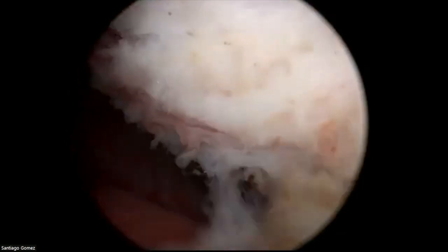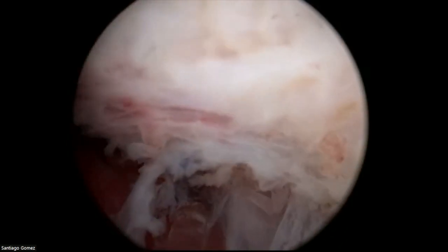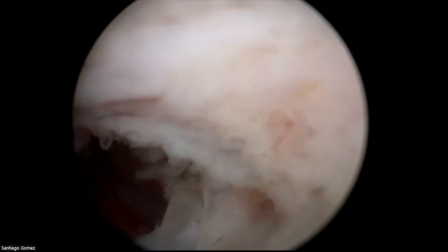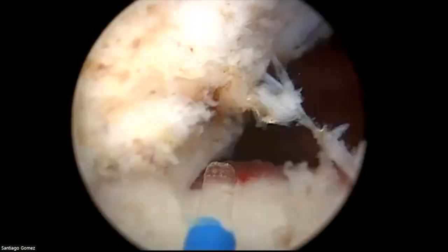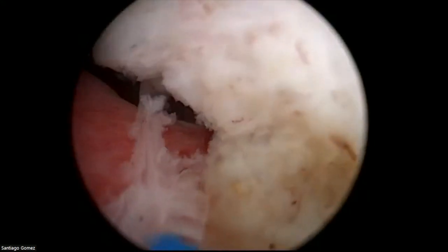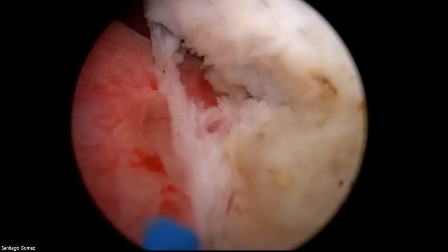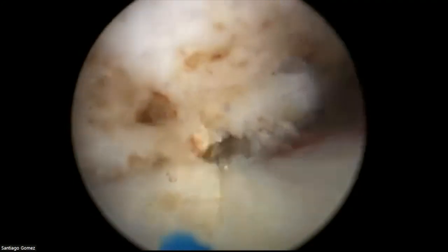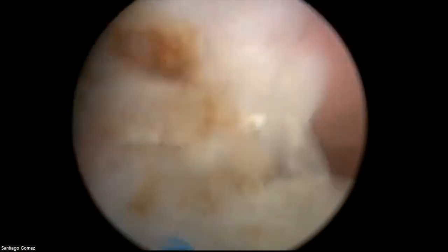But when you see many cases and you recognize the basic principles of HoLEP, you can understand better that there are easy cases and difficult cases, but as long as you stick to the surgical principles, the UO is here. You see that? It's quite close to where we are working. So as long as you adhere to these surgical principles, everything is going to be okay.